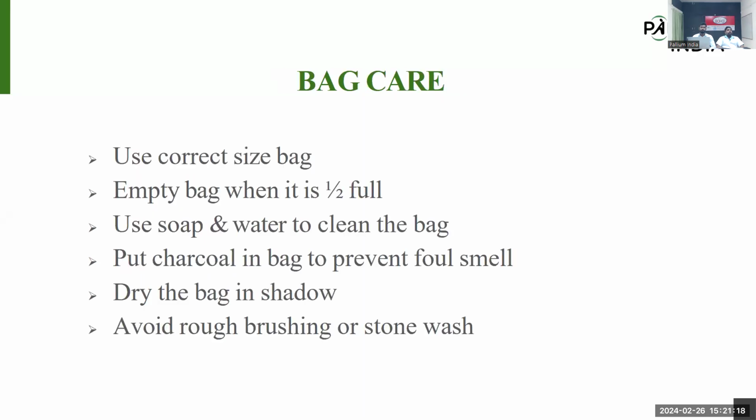Now we have already covered stomal care. Here we are going to see about bag care. As already told, use the correct size of bag only, not too tight or too loose. Empty the bag when half full of fecal matter, at maximum three-quarters full. For bag care, we can wash the bag with normal water and soap.